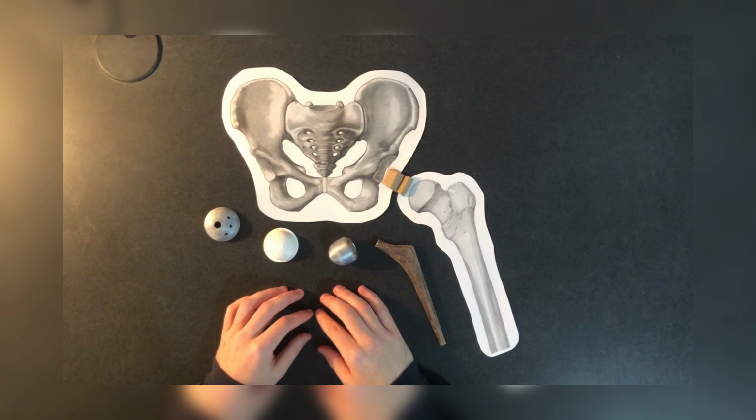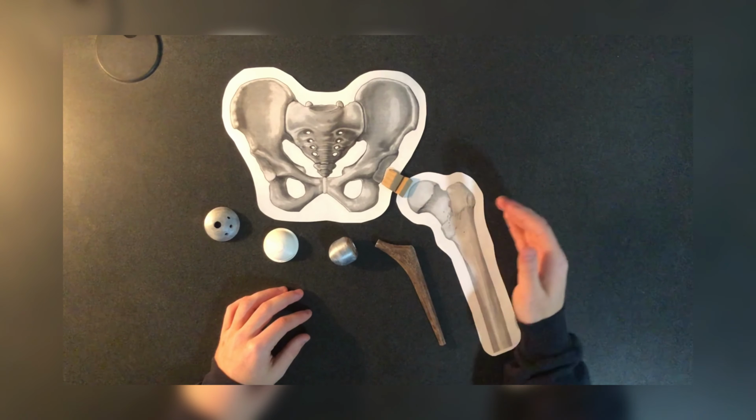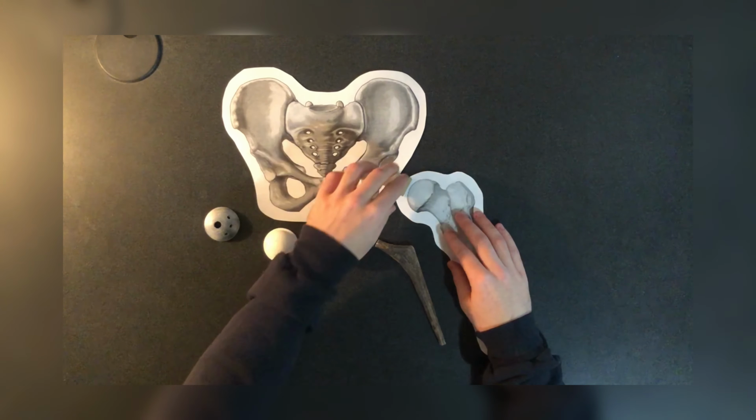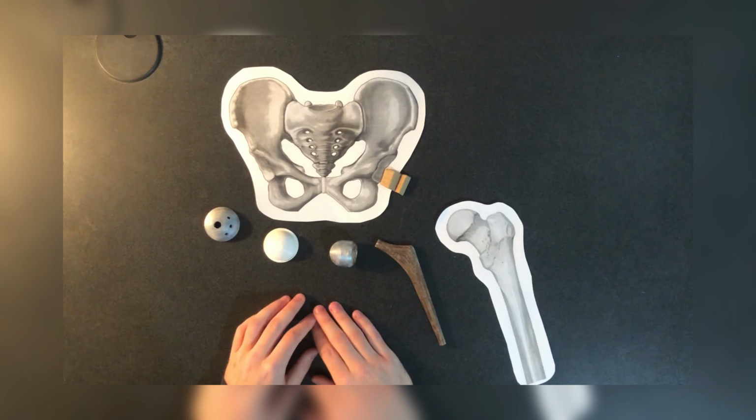The patient is put under anesthesia to remain pain-free during the procedure. An incision is made along either the front or side of the hip, and the layers of muscle are pushed away to expose the hip joint. The surgeon then dislocates the femur, and assembly begins.